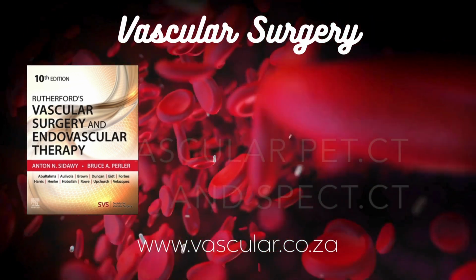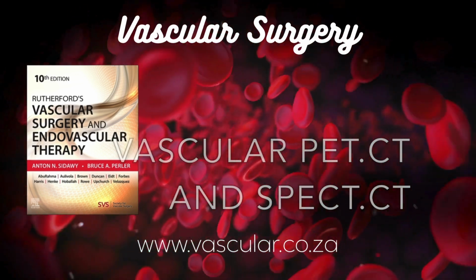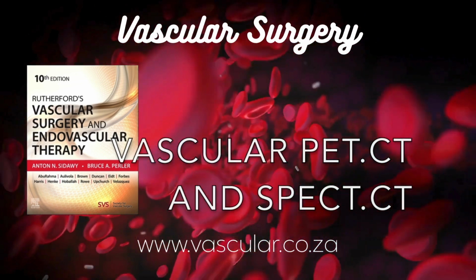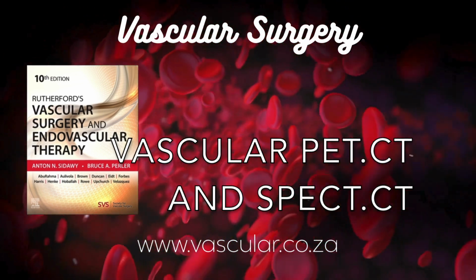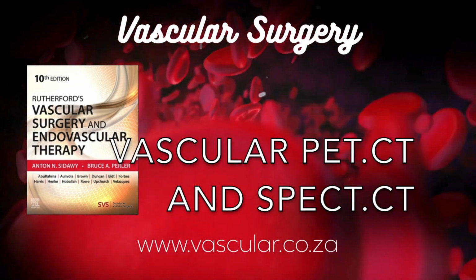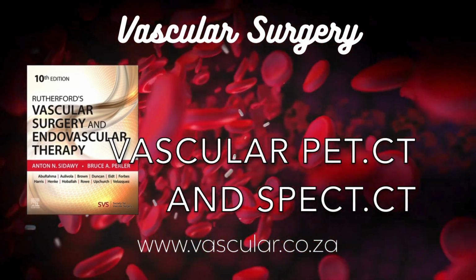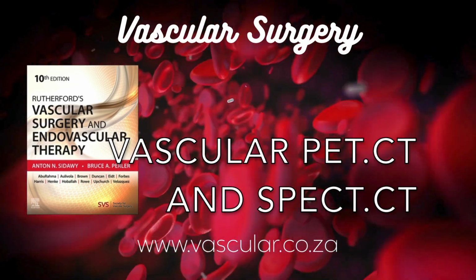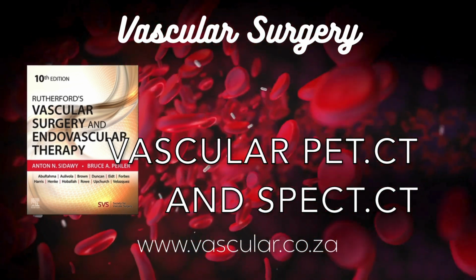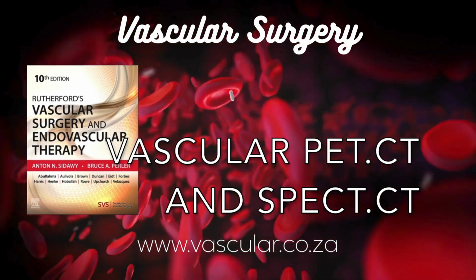Yeah. Now, PET, positron emission tomography, uses tracers that emit positrons. A positron is like an anti-electron. Whoa, okay. When it bumps into an electron nearby, and there are plenty of those in your body, they annihilate each other. Poof. Annihilate. Sounds dramatic. It is, at a tiny scale. But what's key is that this annihilation creates two photons that shoot off in exactly opposite directions. Okay. PET scanners are designed specifically to detect these pairs of photons arriving at opposite sides of the scanner at the same time. This coincidence detection allows for much better localization.